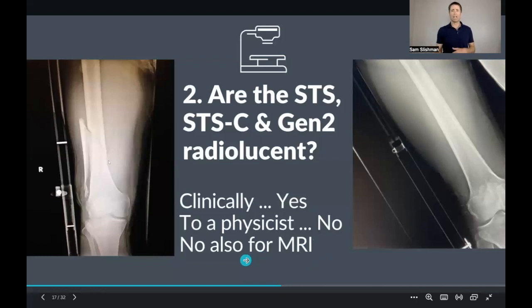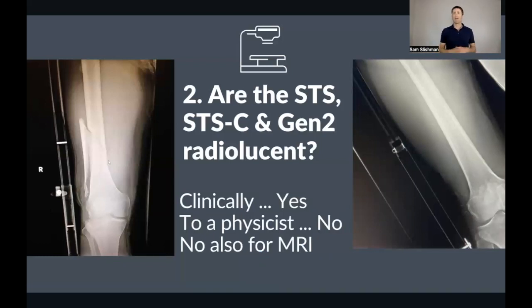Also, can you do an MRI with these splints on? I've never tried, and I'd like to, because I'm really curious how much a couple of washers in there that are steel, and the screws, how much of a difference would those make in an MRI? But anyway, no to an MRI. Maybe one day I'll make these products with nylon or some type of plastic, but I think clinically it's not too relevant having the ability to do an MRI, not in the emergency department.